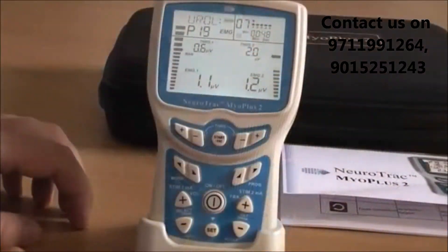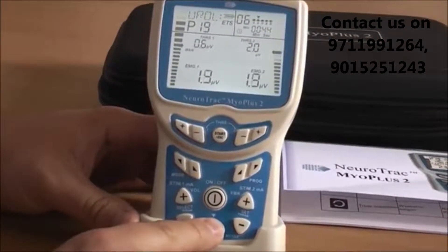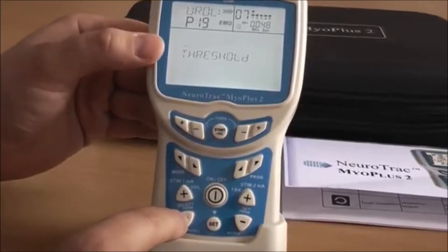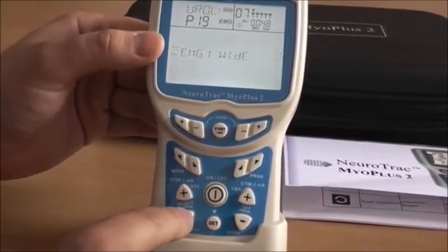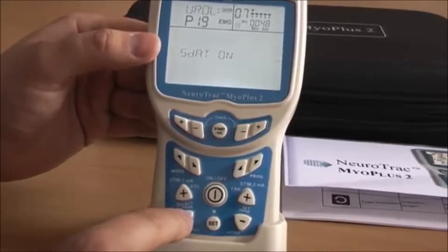The preset treatment is fixed, but you can still change the common parameters such as sound volume and PC connectivity. By pressing and holding the Set button, you can change sound volume, auto or manual threshold, bar graph sound, EMG filter, and the PC connection status. If you cannot find the parameter you want to adjust, you can find it in one of the custom programs.